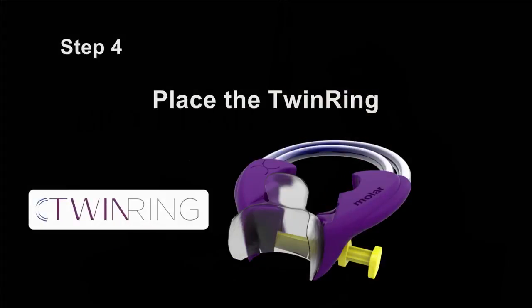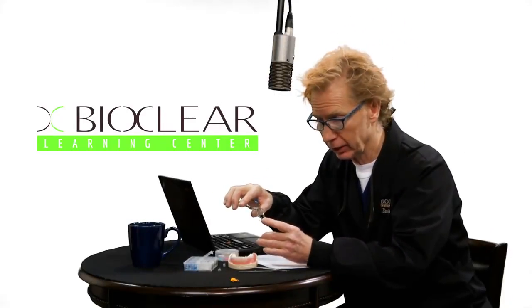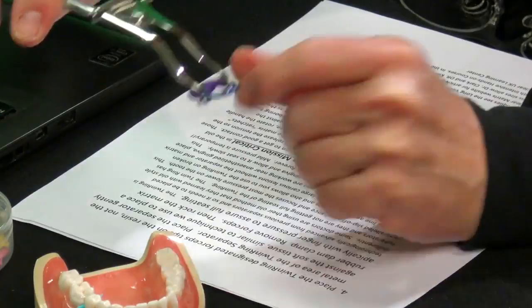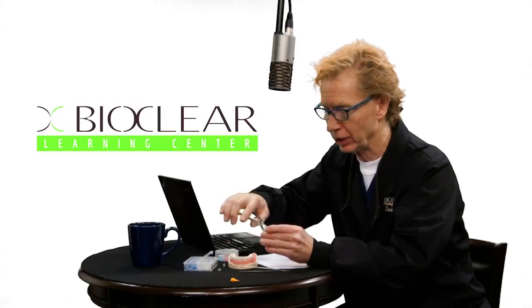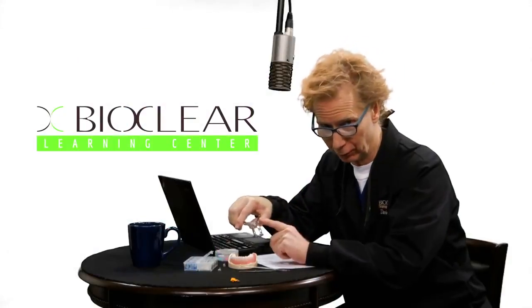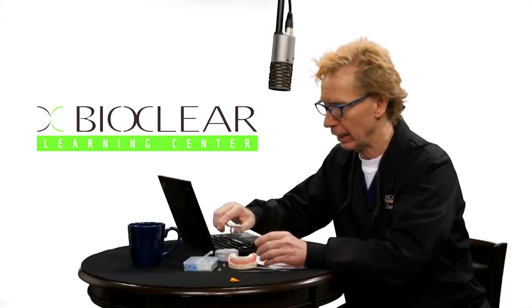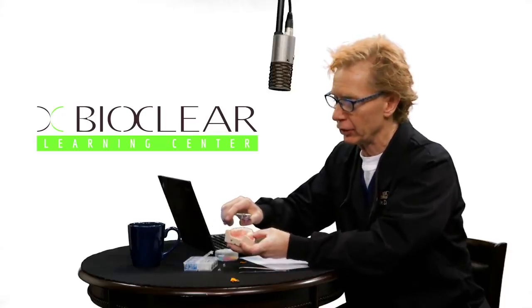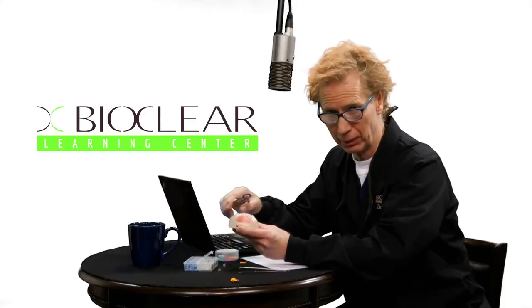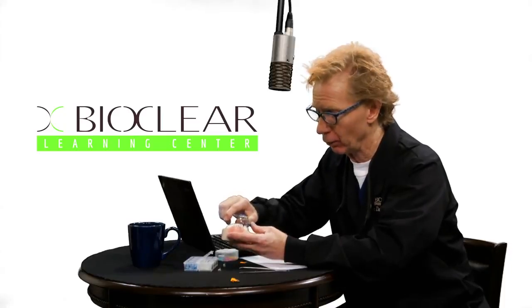Step four: get the special forceps for the twin ring. Make sure to place the tines of the forceps on the resin part of the separator, not on the metal — you have no power on the metal and can damage the separator. Place it on the resin portion and use the appropriate twin ring forceps, not just whatever forceps you have laying around. You'll notice you have a lot of power with the way this is arranged. Place the separator more like a rubber dam clamp rather than the old thinking with traditional separators — it goes apically and stays well seated to avoid slip-off.